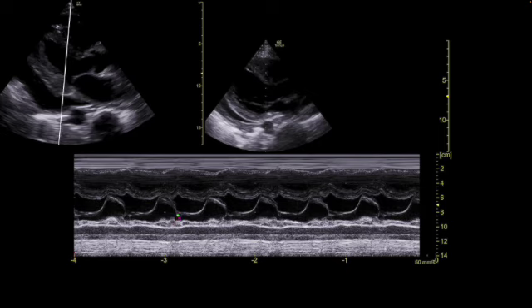This looks familiar, right? Where is my mitral valve? Here's my mitral valve at about 8 centimeters. Here it is, right? Opening, closing, opening, closing. Here's my septum at about 6 centimeters. But instead of assessing if my mitral valve is hitting my septum and how far away from it is, we don't care about that. We don't care about the ejection fraction necessarily in this patient. We already qualitatively assessed it and it was normal.